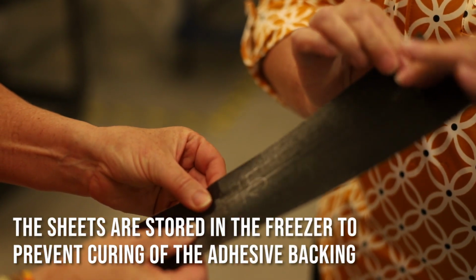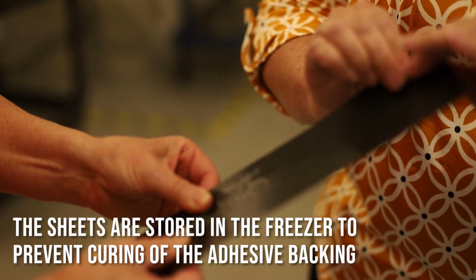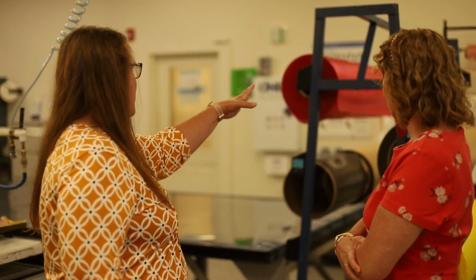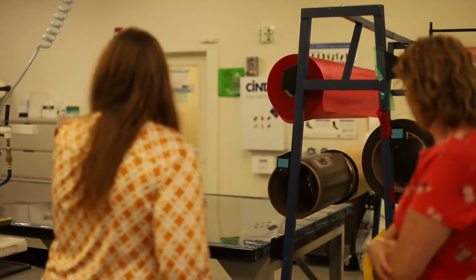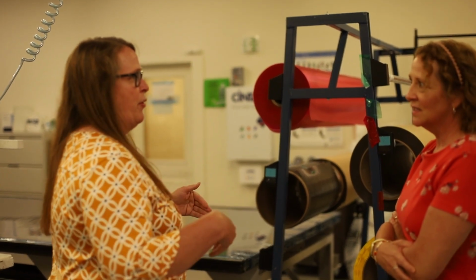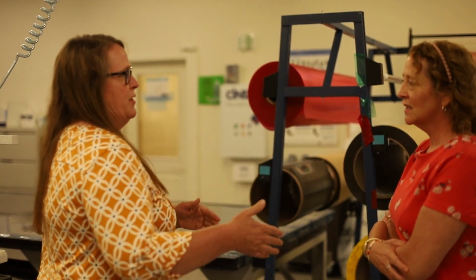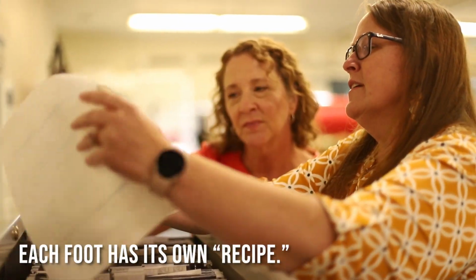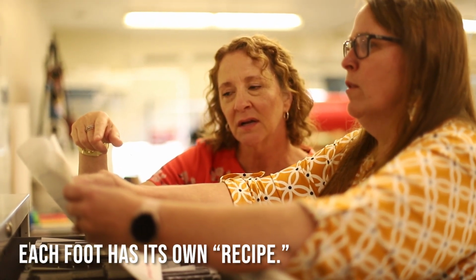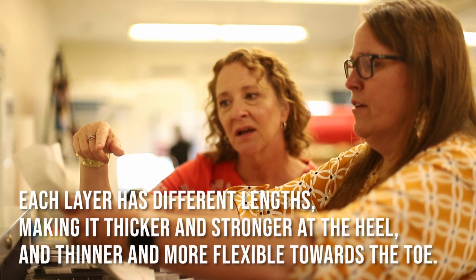And you have to keep it stored in the freezer until we're ready to use it, or else the resin will cure. So when we bring it out, we put it on a rack, and then we pull it out on the cutting table, and this will automatically cut it, the CNC program. It'll cut the plies that we use. And then when you go here, it tells you exactly which layers go where, how long each layer is. So you can lay it up going by each layer.